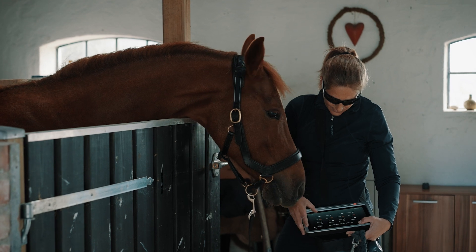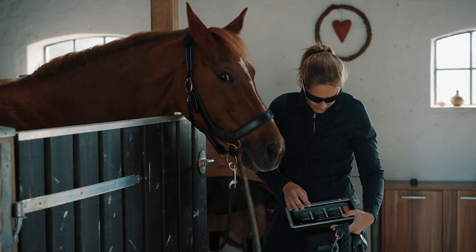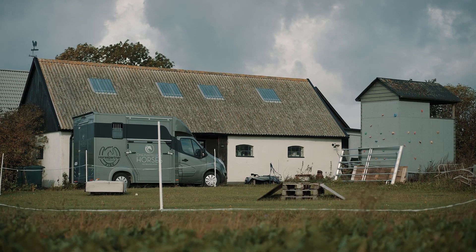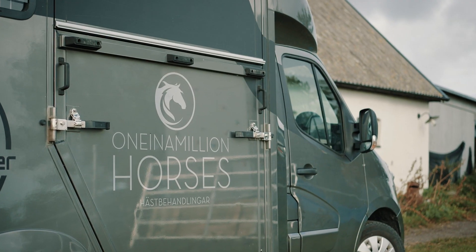Either I go out to the stables, meet a horse, and find a sore or tense back that I treat using it together with my manual treatments. Otherwise I have a prescription from a vet to treat six times and then go back to the vet for a check.